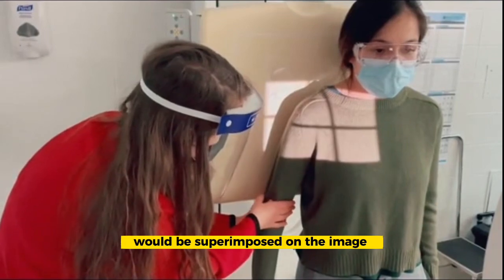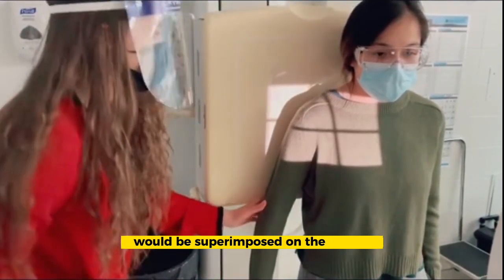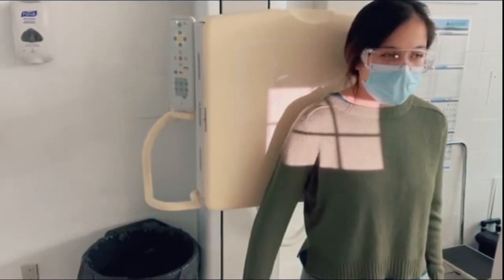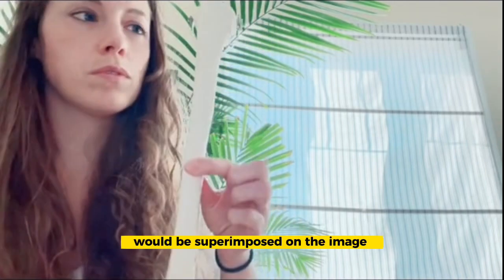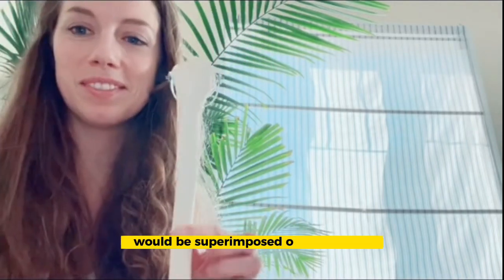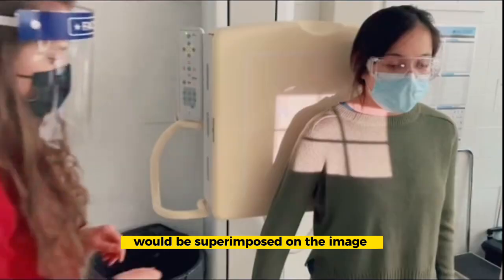For the AP projection of the shoulder with neutral rotation, the epicondyles should be placed at approximately 45 degrees. If they are placed at 45 degrees, then at the proximal end, we would expect nothing to be in profile. A helpful memory aid: neutral starts with N and nothing starts with N.